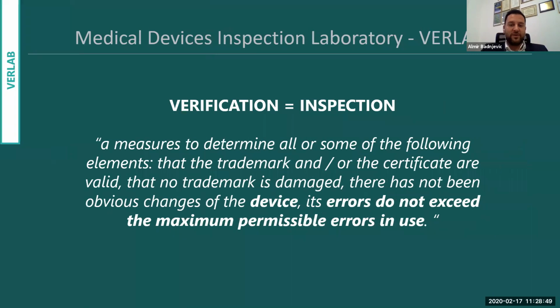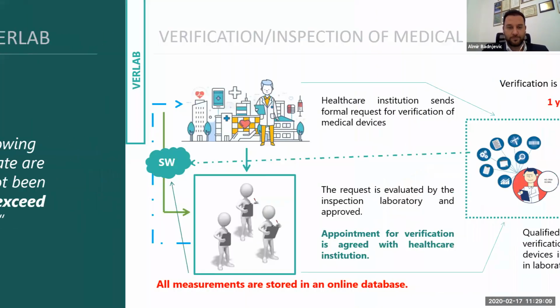I put it here that verification and inspection are the same terms, but when we are talking in the metrological field, we say verification. But when you go to the accreditation part, when you read the standards, this term verification is written as inspection.